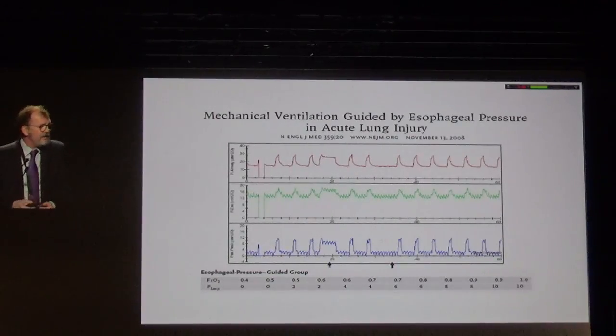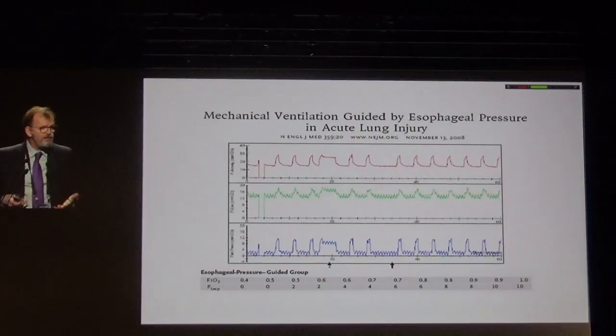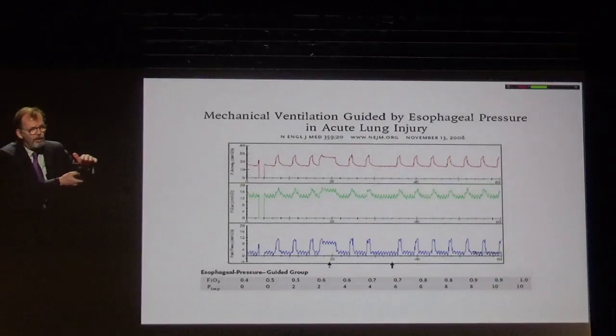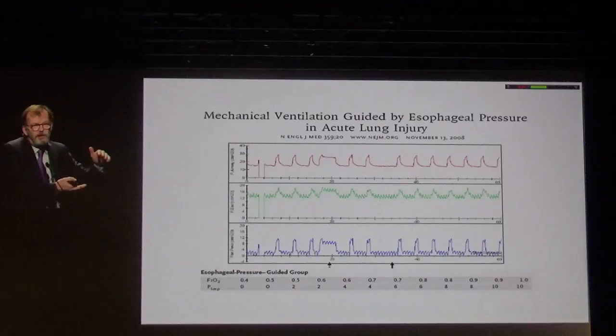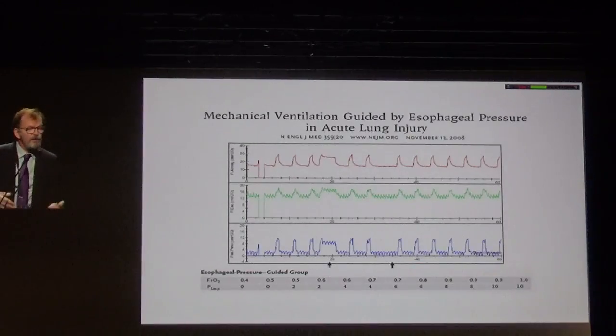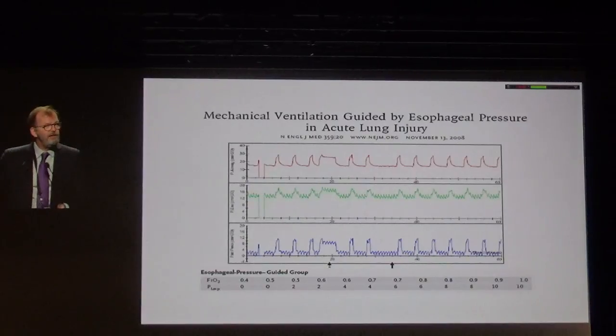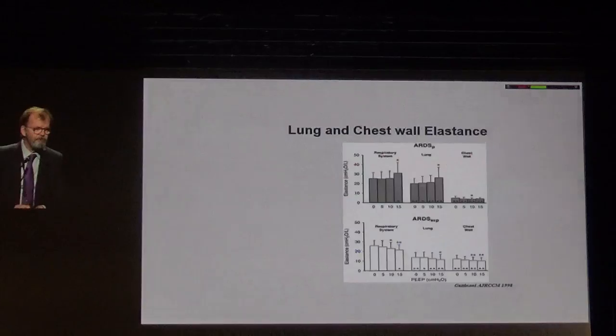And maybe this is interesting because at mid-chest, this is where supposedly there is this whole story of opening and collapse. So you try to keep the lung open at mid-chest by maintaining a positive transpulmonary pressure. We don't know whether it's the right way to do, but it has a lot of sense and it has credibility based on this data.